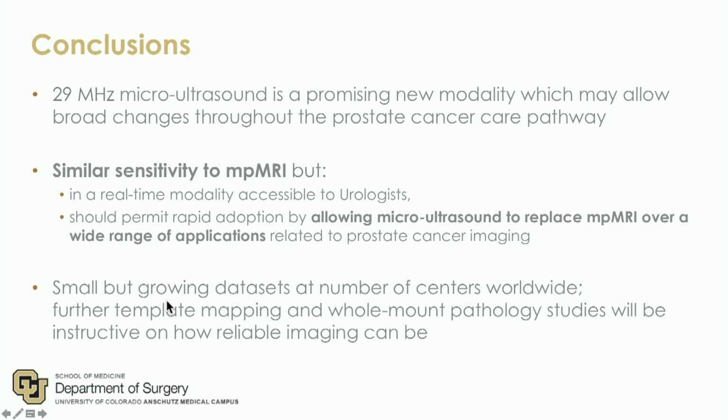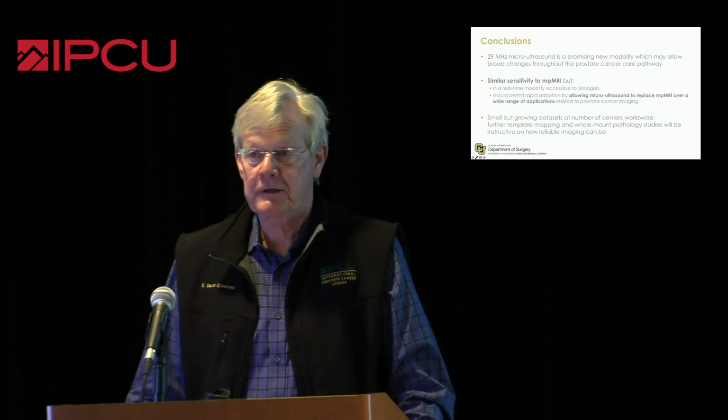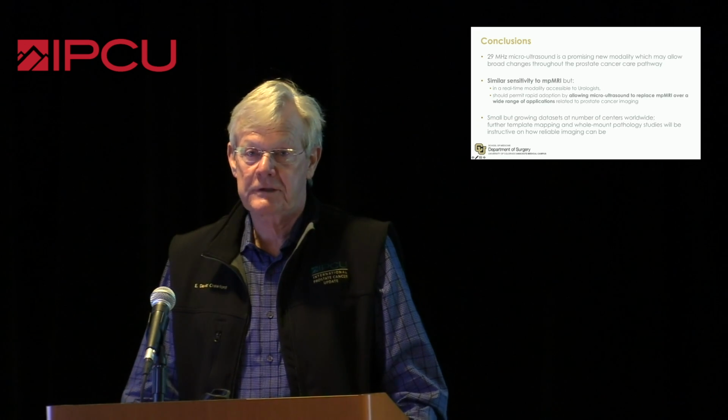So in conclusion, 29 megahertz ultrasound is a promising new modality. We have 3 people that have presented that right now. We think that it has similar sensitivity to multiparametric MRI. I agree with Dr. Klotz that there's a learning curve that exists that's significant. And this is a disruptive technology, and there's no question.